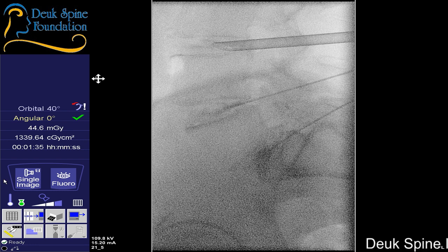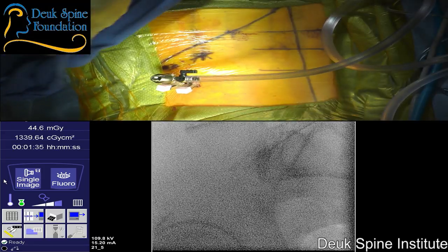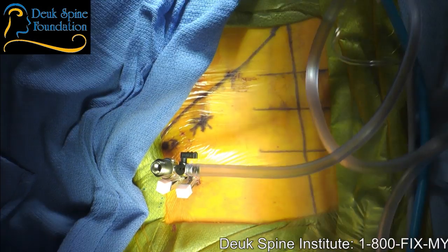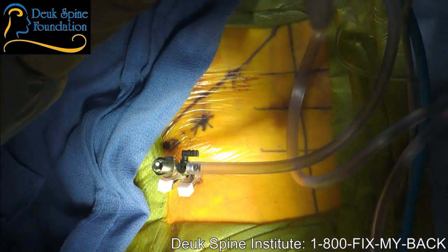Whereas a fusion is a much longer recovery. So this whole surgery is done through this little metal tube. Zach, do we have any questions from our audience? We do have one, actually.